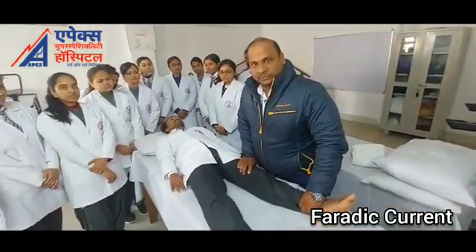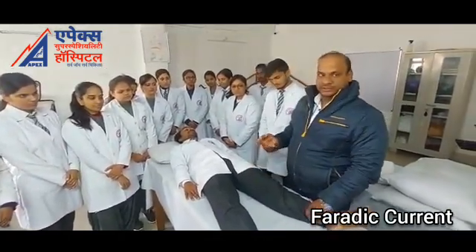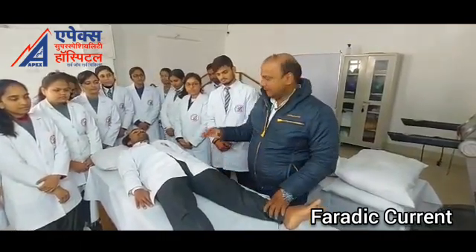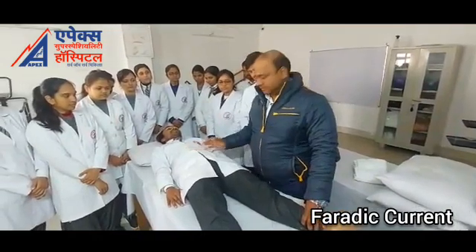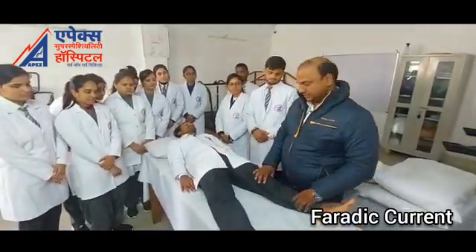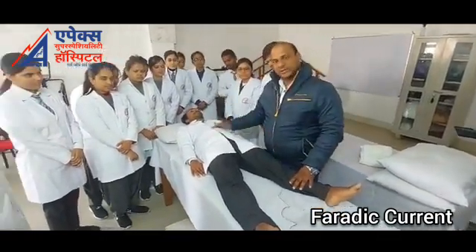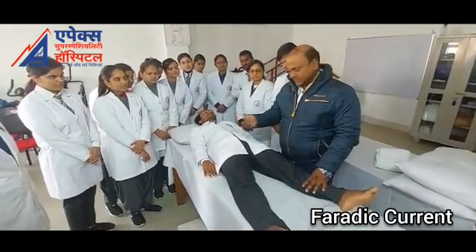Now we are moving to start the procedure. Firstly we need a patient who is having edema, and to relieve edema we lie the patient on a couch. Patient is in supine position on the couch, and the therapist who is performing the Faradism under pressure is besides the patient.